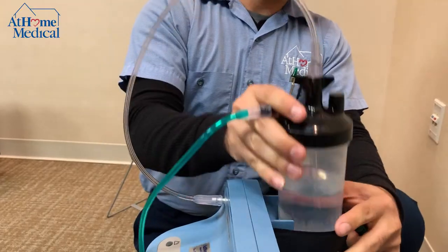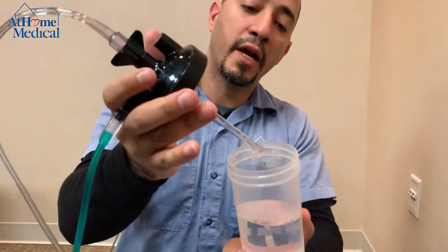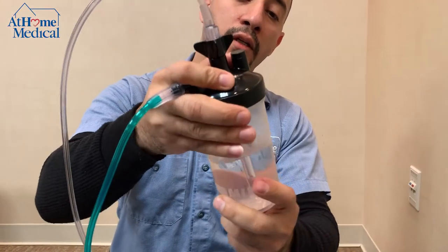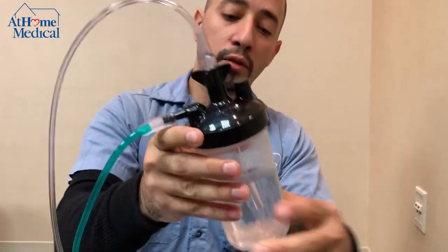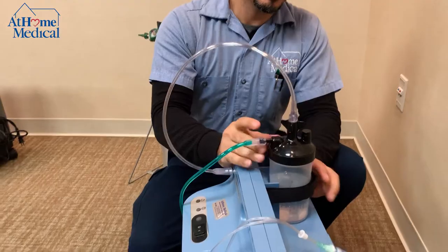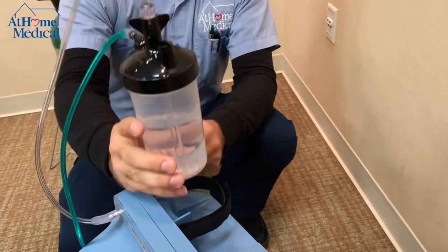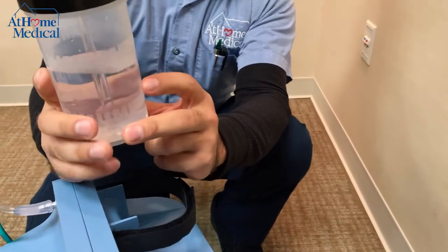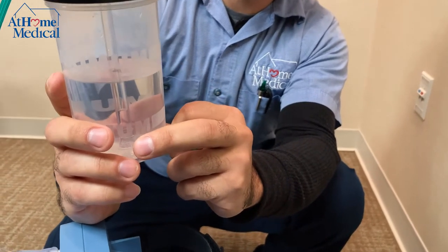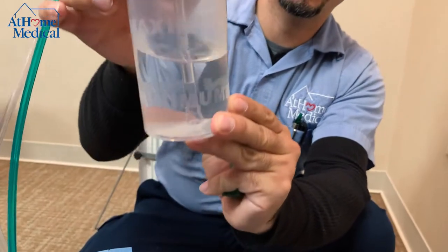Always make sure that when adding water, you catch all the threading so there's no leakage. On the humidifier bottle you'll have a maximum and minimum indicator — showing when not to overflow and when you should add water.